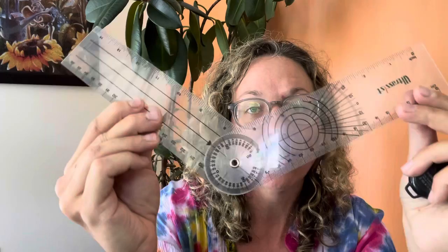Being an analytical, data-driven person myself, I want to know the why behind things, like give me the numbers to prove to me the financials or whatever, so I'm very analytical in nature. And the very first day that she brought this goniometer out to measure the angle of where my arm was, you put the circular point at the elbow joint itself, and then picture this part up towards your shoulder and this part towards your wrist, and you're opening and closing to see how far you can move the arm. How much range of motion are you getting? And essentially, if you start like this, you want your numbers to get better and better till you can extend.